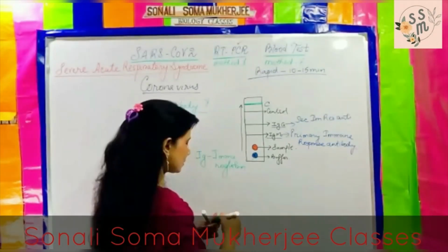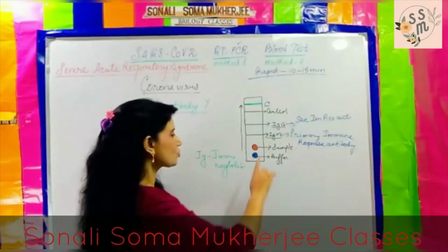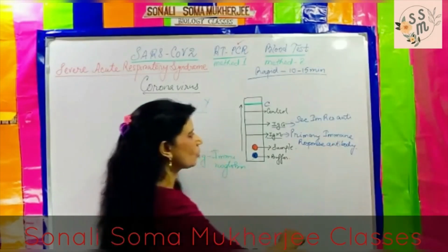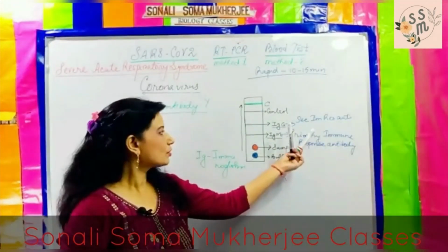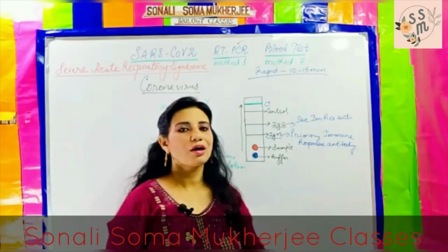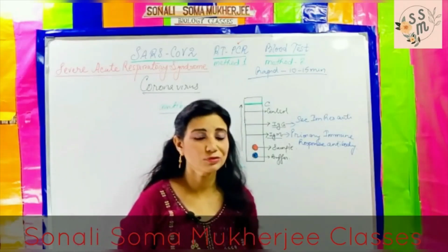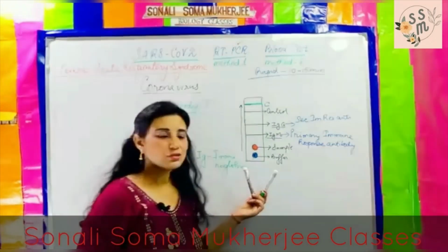And this signifies the primary immune response antibody. So if there is no line in the primary immune response antibody or the secondary immune response antibody, but at the control section there is a line, that means the test has run, you are not tested positive, you are negative, you do not carry SARS-CoV-2. So the test is finished over there.